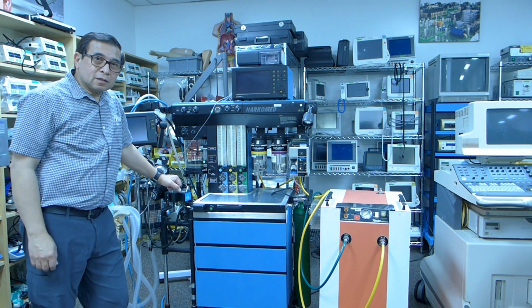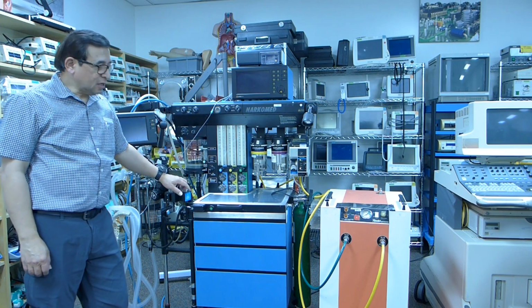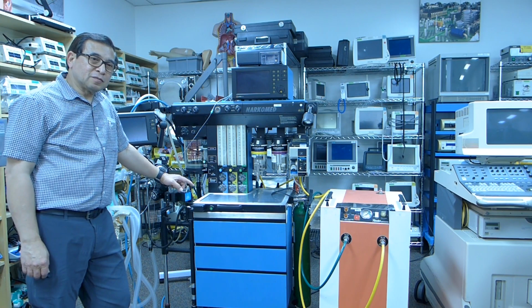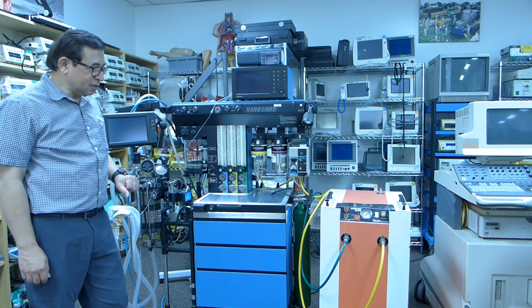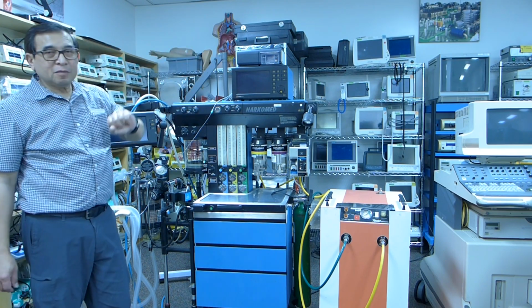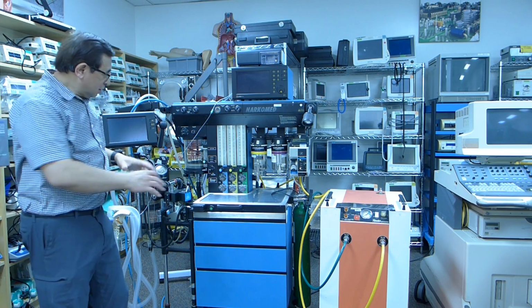Hi everyone. Today we're going to go over the anesthesia machine, and also the air compressor. That is a standalone air compressor which provides air pressure to the anesthesia machine for simulations, so we can learn. This is in the lab. We don't have the medical pipeline system in this lab, so we use the standalone air compressor.